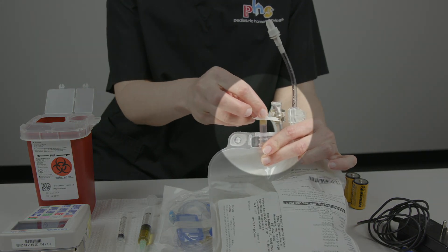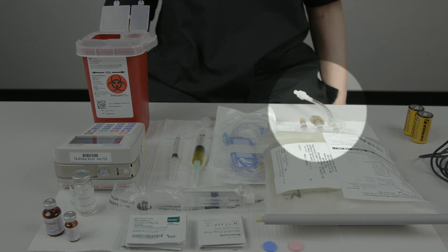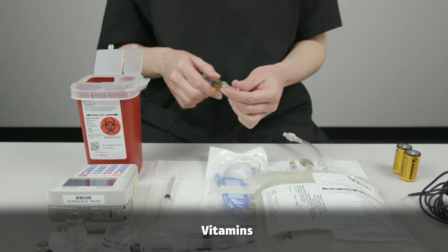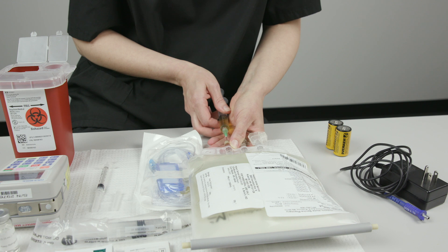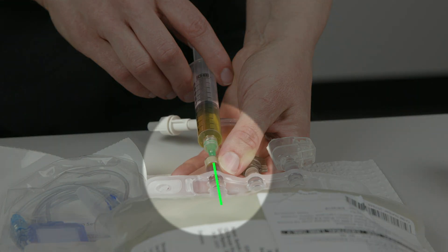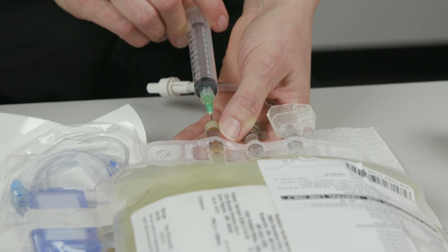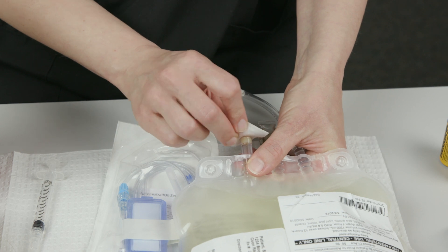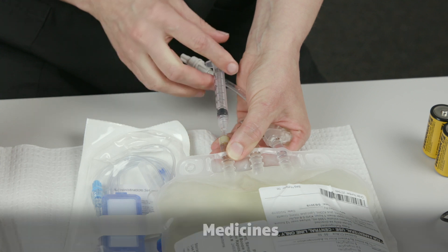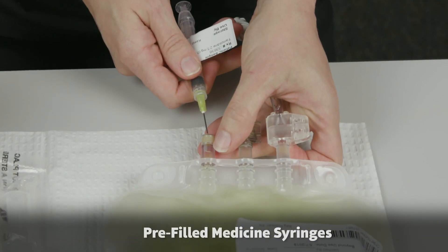Scrub the injection port on the HPN bag for 15 to 30 seconds with an alcohol pad. Carefully lay the bag on the safe zone without letting the injection port touch the surface. Allow the port to air dry. Remove the cap from the needle on the vitamin syringe. Insert the needle straight into the center of the injection port on the HPN bag. Do not poke the needle into the side of the injection port or the bag. Push the syringe plunger until all of the fluid has been added to the bag, then remove the needle from the injection port. Put the empty syringe with the needle attached into the sharps container. Repeat these steps with each syringe including vitamins, medicines, and any pre-filled medicine syringes sent by the pharmacy.